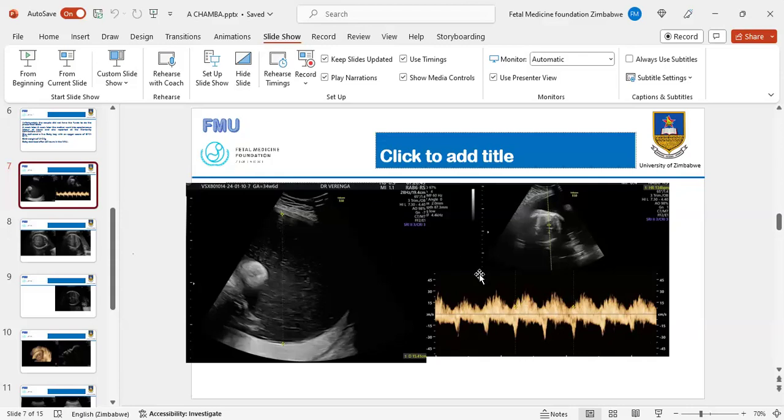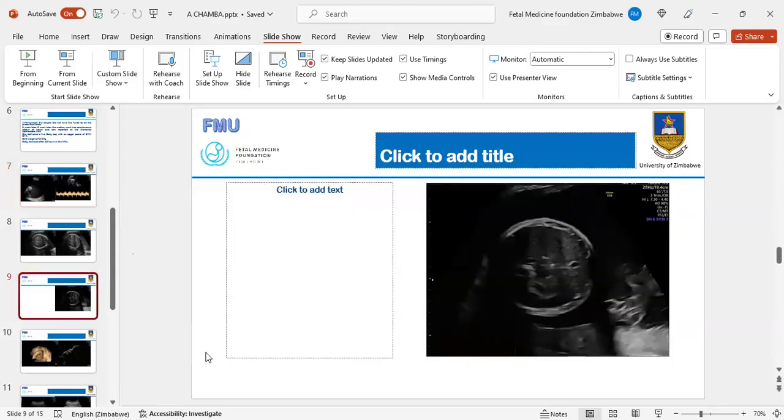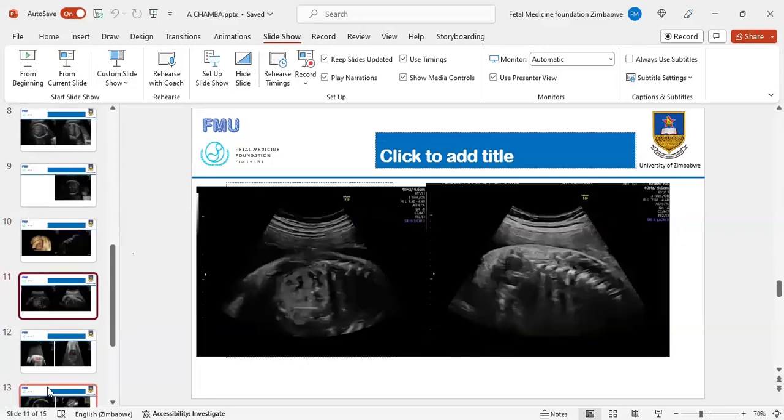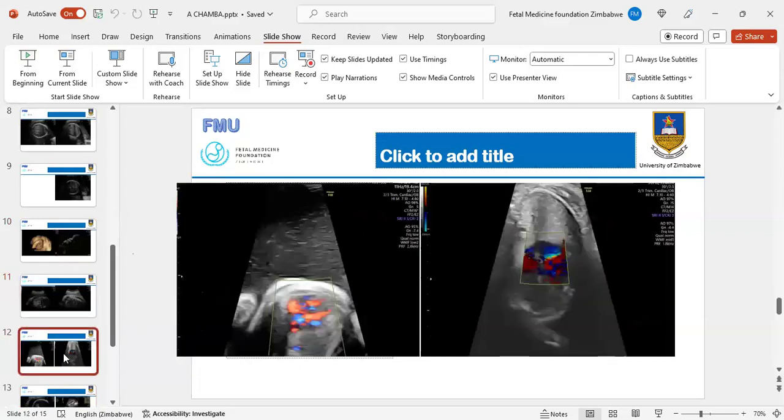On the second image, there is the fetal heart. Then on the following image, we couldn't visualize it. It was very difficult to see a fluid-filled stomach bubble, and this one has the 3D. Then on the nasal bone, the baby had the nasal bone present, and it was within normal limits considering the gestational age. Those are part of the spine, and also the kidneys were normal.